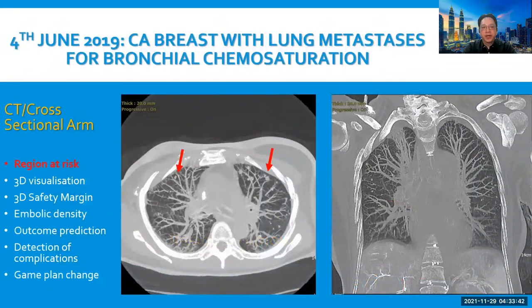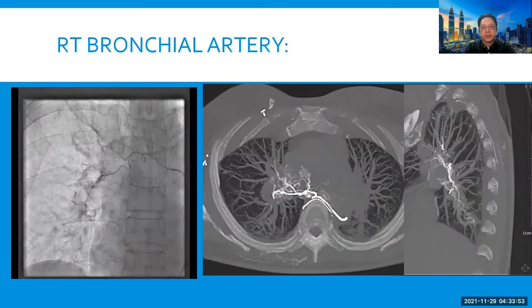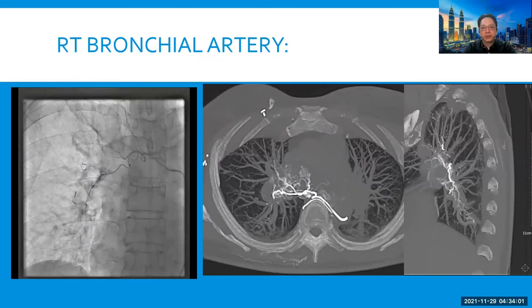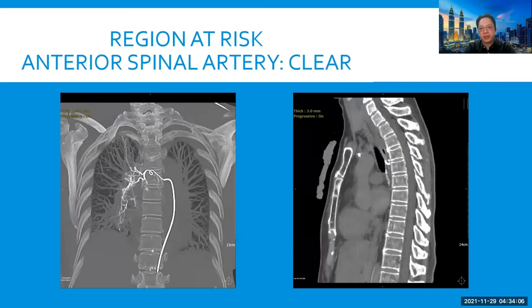In this patient with CA breast and bilateral lung metastasis, she was referred for bronchial chemo-saturation for salvage therapy. The region at risk is the anterior spinal artery. The microcatheter in the right bronchial artery and CT right bronchial arteriogram shows denser opacification in the right tracheobronchial system. On the sagittal reconstruction, the anterior spinal artery was not seen, and we are clear to proceed.